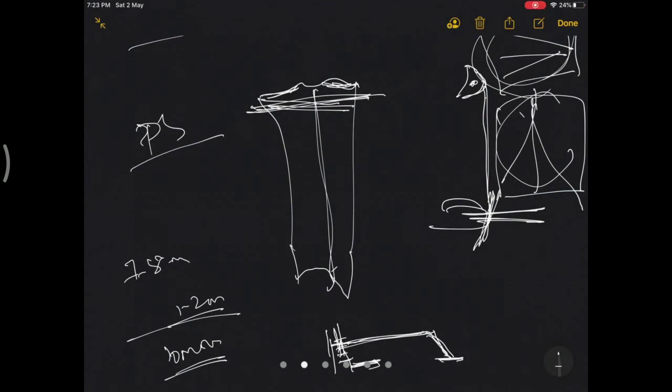So what most people do is they take the almost pristine lateral compartment. Many times the lateral compartment is preserved. So you assess the amount of wear, and if you feel there is some amount of wear, then you adjust accordingly. The idea is that you cut appropriately considering all this bone loss, because the soft tissues are acquainted with the tissue which was there.